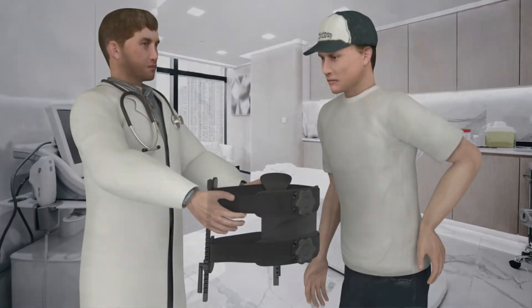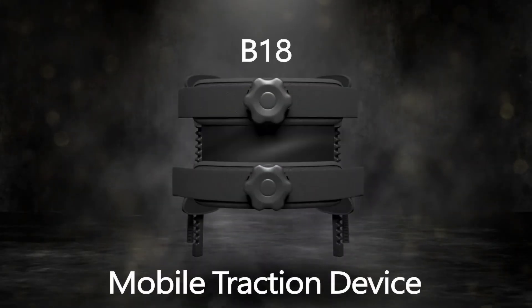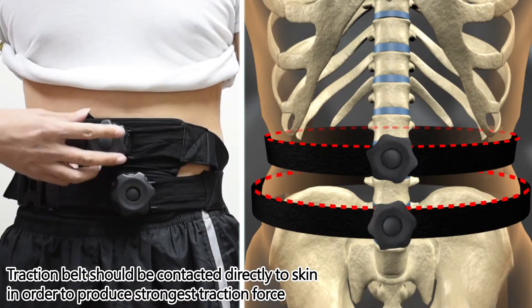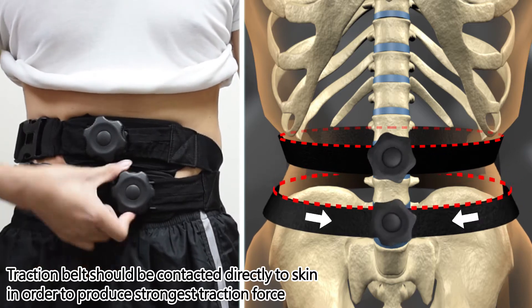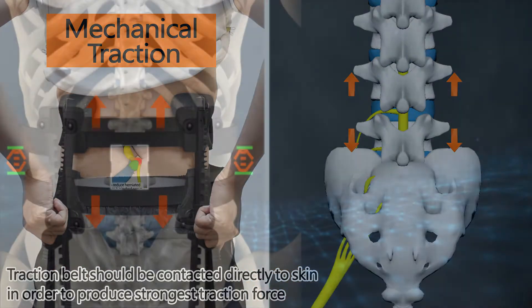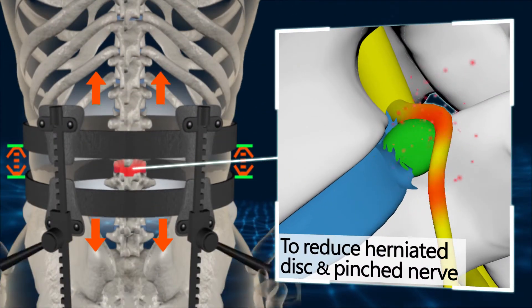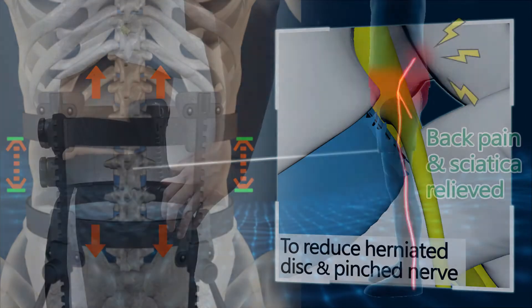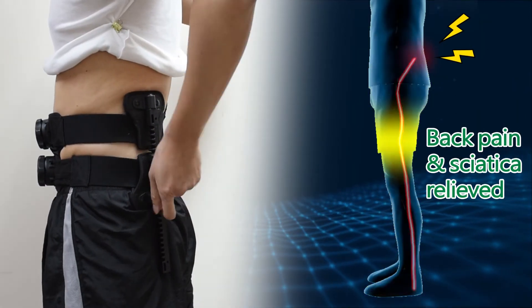This can be fixed by a mobile traction device — mechanical traction. Traction is used to reduce the herniated disc and relieve the pinched nerve, thus relieving back pain and sciatica.